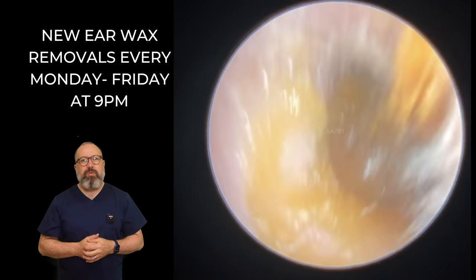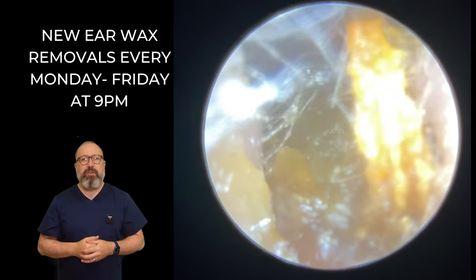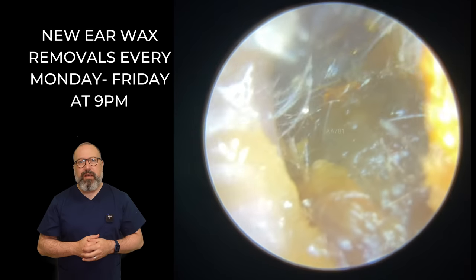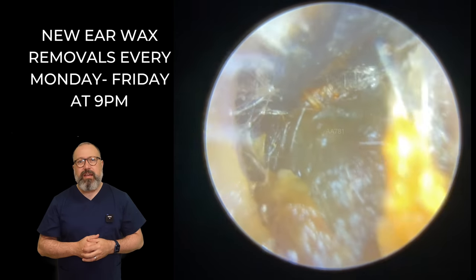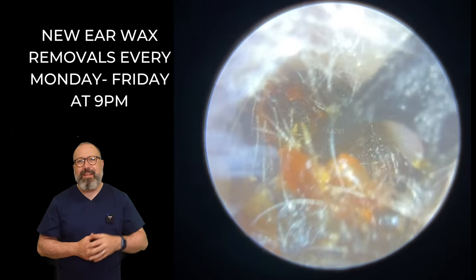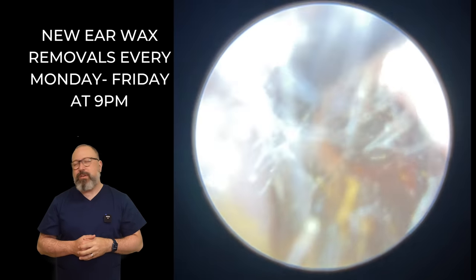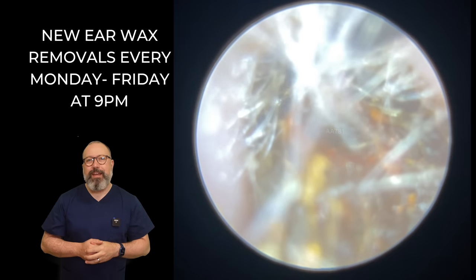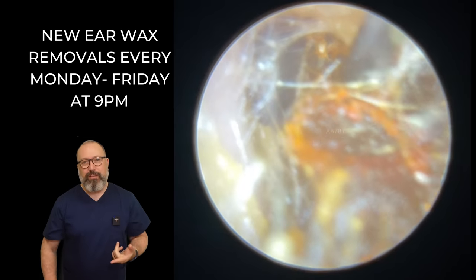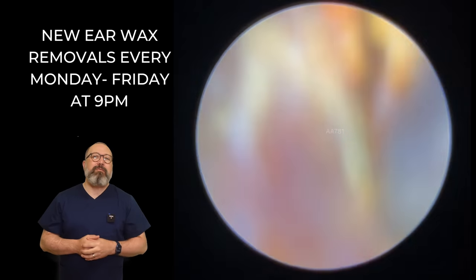It wasn't really causing them any issues, but because it was there the patient wanted it out. So we just started pulling this plug. You can see I'm kind of holding on to the one side. There's a little bit of skin just popped out the side, but we've got the Jobson horn out. Let's get this back in and see if we can get beyond it and start to pull this down. Sometimes the angle you have to work at with the Jobson horn just doesn't mean you can get behind it very easily, and that's what's happening here. So — Rosen Inserter. We've had all the curettage tools today: Rosen Inserter, St. Bart's hook, Jobson horn, forceps, and suction. So we've had the whole lot in this video, but it's coming away really, really well.